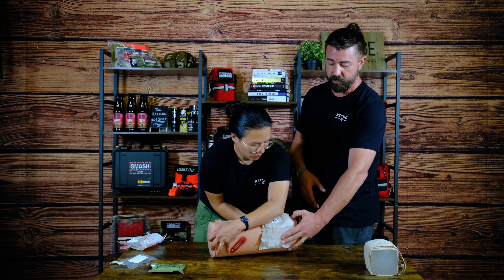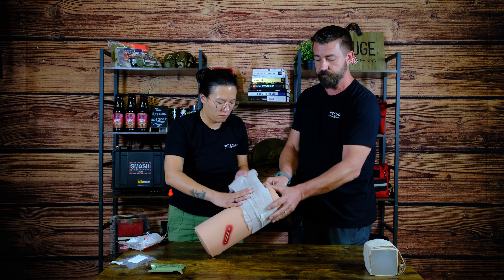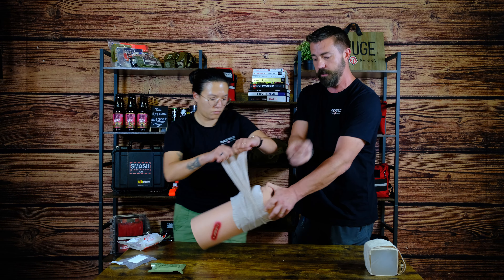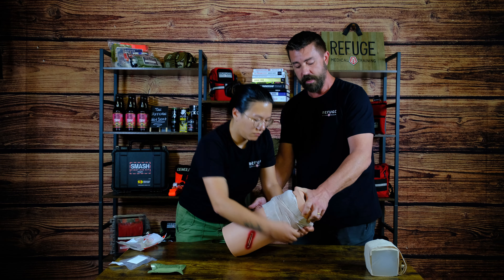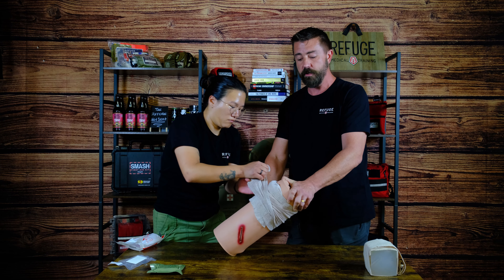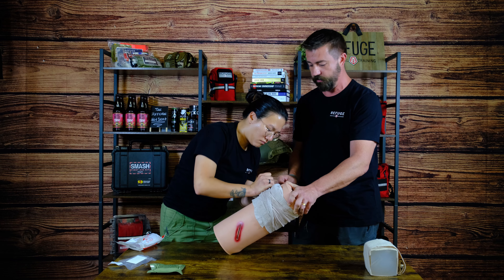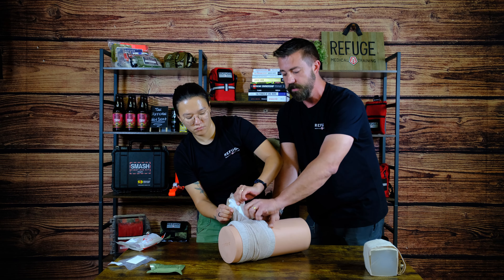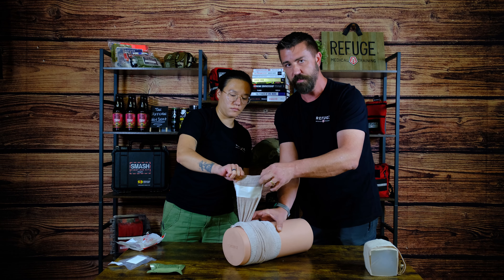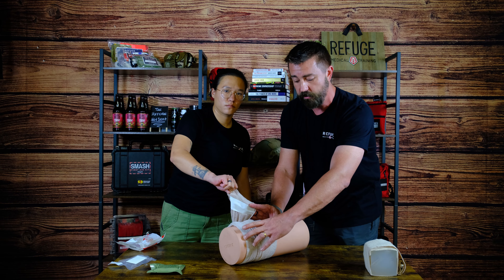With the gauze pad towards the side of the injury, you will wrap it around. That first wrap is mostly to hold it in place. On the next wrap, you're going to twist it, and that puts six inches of pressure into one inch. Don't be afraid to pull it tight. Now, whoever you're working on is not going to be pleased when you're doing this. It's important to talk to your casualty — let them know that what you're doing is important for their survival. Once you reach the end, pull it out where they can see it. There are different types of ways to secure this: some are just Velcro, some have plastic clips. If it has plastic clips, only try to clip them on the outer edge — don't try to wrap them around the entire pack bundle or they will break.